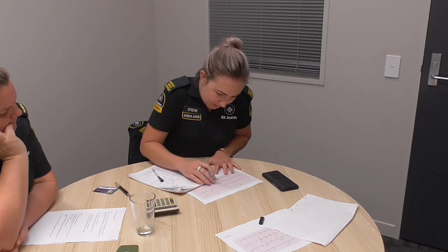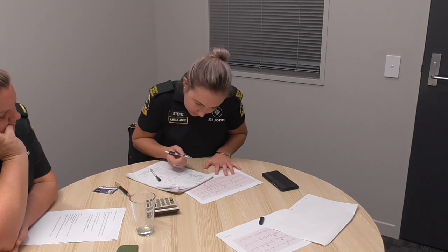The PR interval is ruling out first degree heart block.